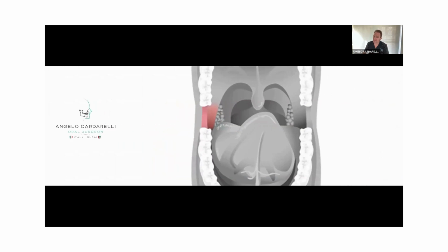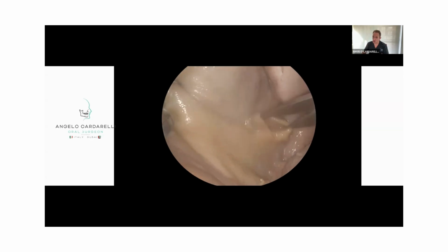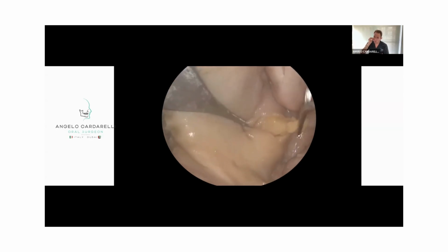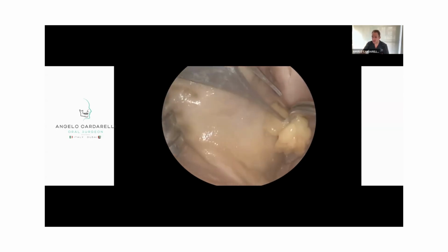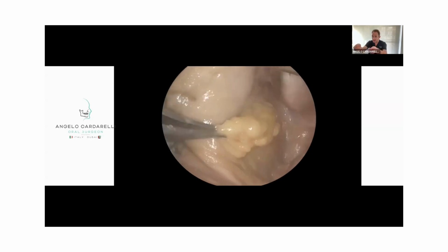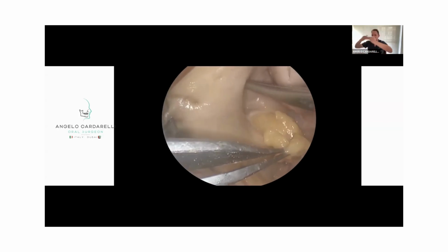And regarding the maxilla, as I told before, I always use the fat that we have in the thickness of the cheek. And here in this small video on the cadaver head, I will show how we can reach and how we can find this fat in the cheek. We don't need to cut, just to release. Why? Because with this incision, we can release more of the fat, and with this flap, we can cover the customized implant.